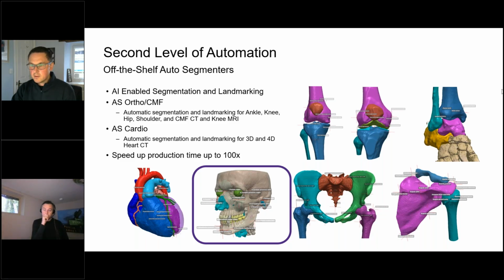What was the slice thickness in this demo? Just double check that one. The slice thickness for these two scans was 0.7 and 0.625. Saying that, try it on any resolution, high or low resolution. It doesn't really matter. And I think there was also a question about whether you can work from higher density raw data than the DICOM 512.